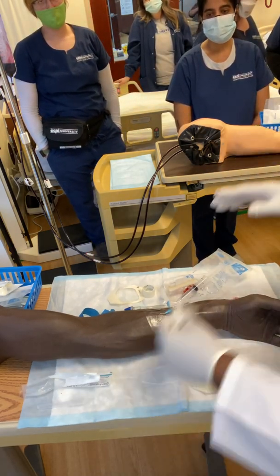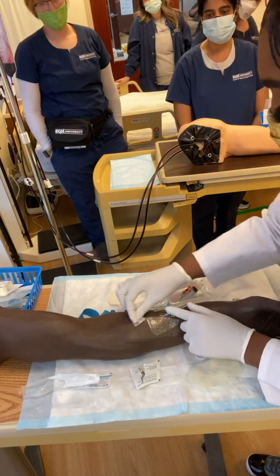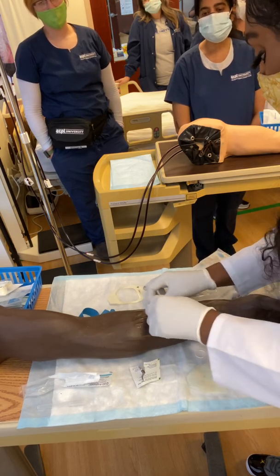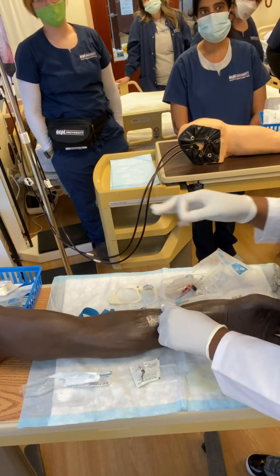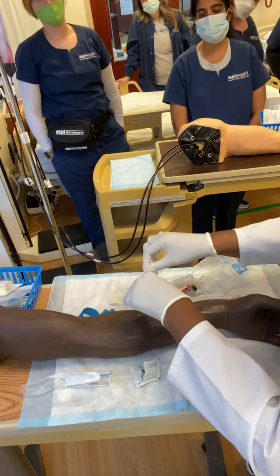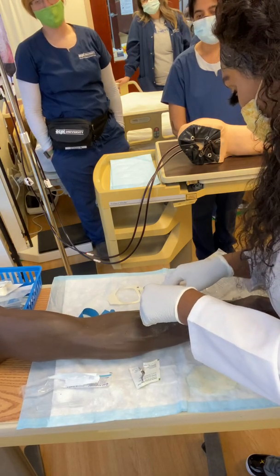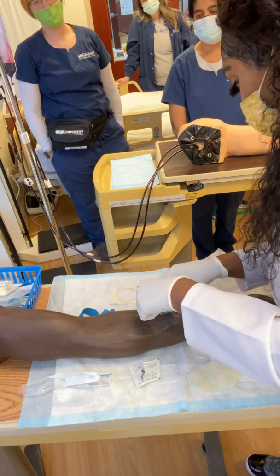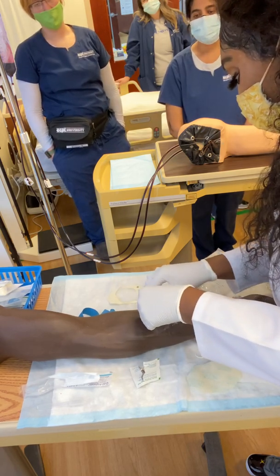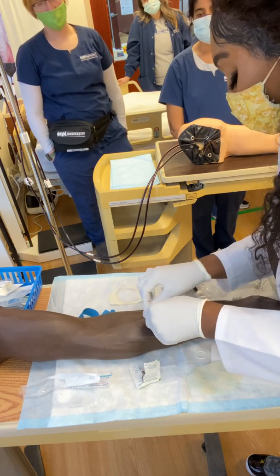Alcohol is your friend. All you have to do is put alcohol here and that outside, and that tape will come right off. Look, it comes right off. You see that hair and that tape. So all you have to do is lift up, and as you're lifting up, you go just like that. And that'll prevent any type of pain to the patient.